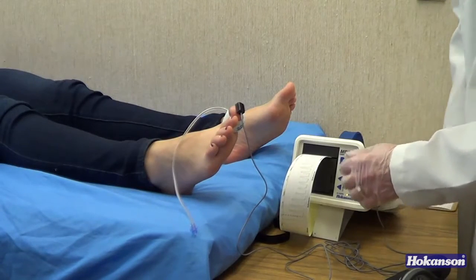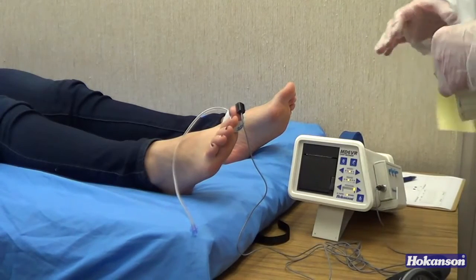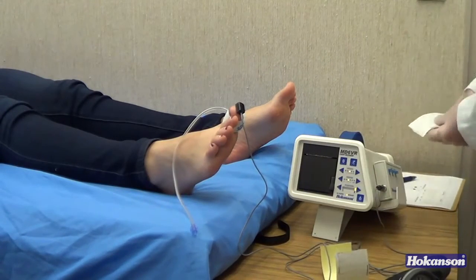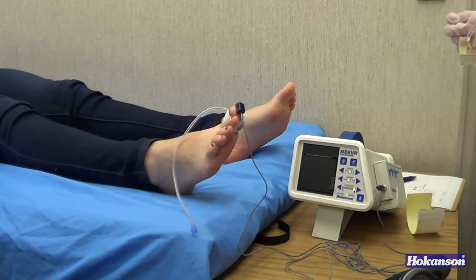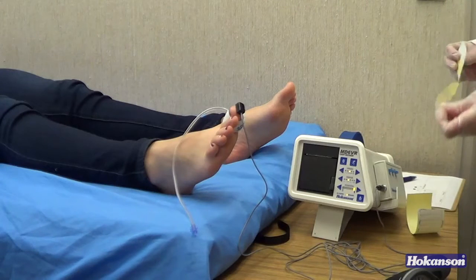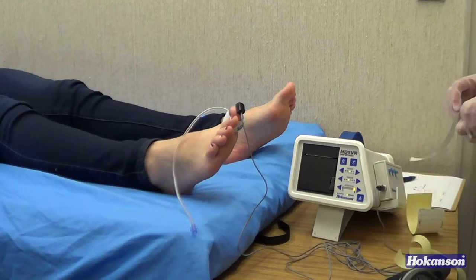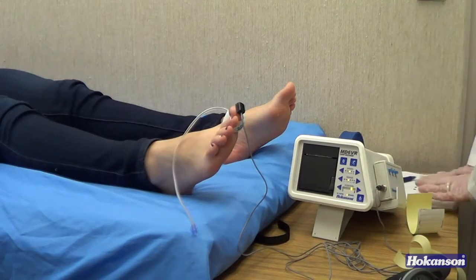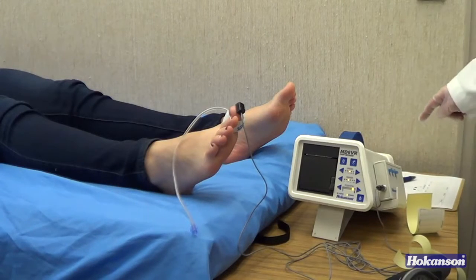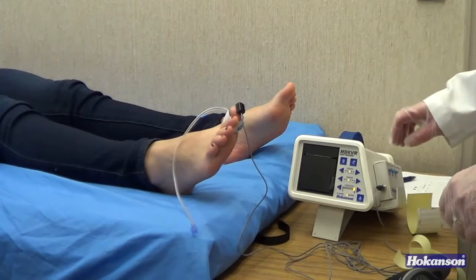So we'll stop that, and we'll tear it off and put it on the patient's report form. This is adhesive back paper, so we can apply it directly onto the report page for the patient. This is the right toe, so we put it on the right toe section of the patient's waveform.